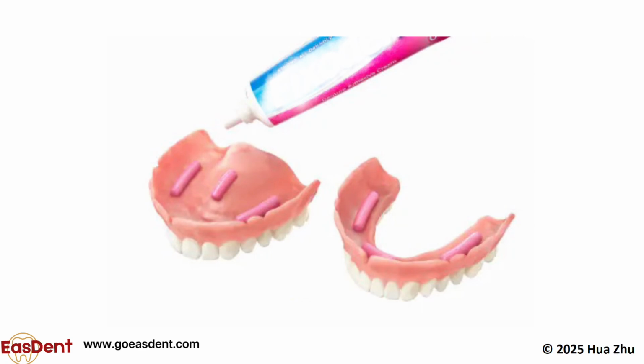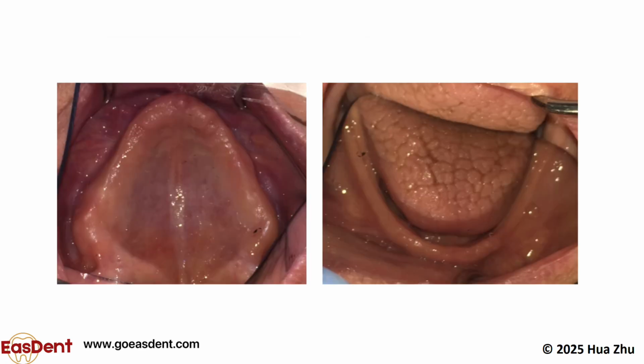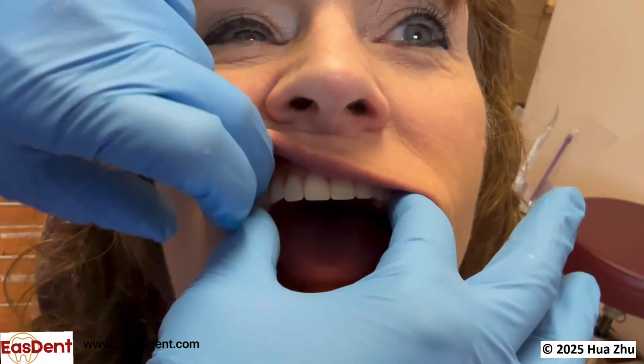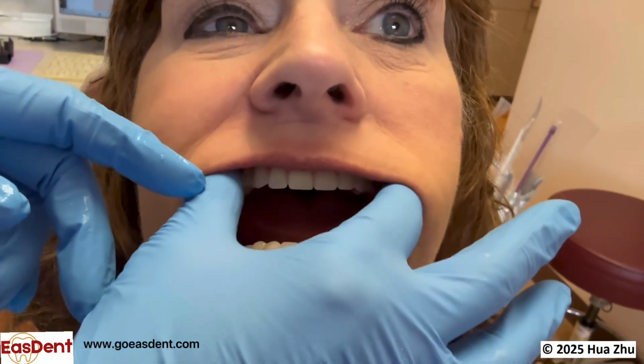Ask the patient if the patient is comfortable with the denture. Does the denture stay in place on its own? Do they need to use denture adhesive? Evaluate in the mouth. Are the denture supporting tissue healthy? Does the denture have good stability and retention? Is the border in the correct position?